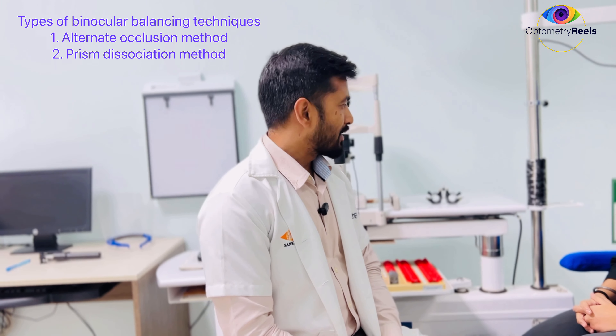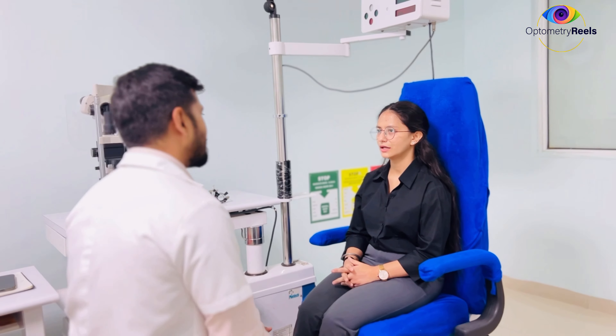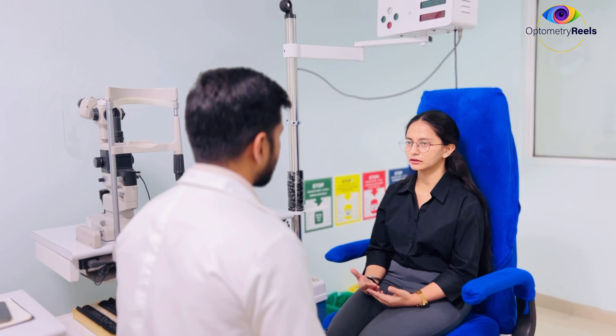I have a patient whose glass prescription is –2 in both eyes. Though her visual acuity with the right and left eye is 6/6, she still has certain complaints. So ma'am, what is the problem with your glasses? Especially while doing near work and reading, I feel eye strain and headache with the glasses.